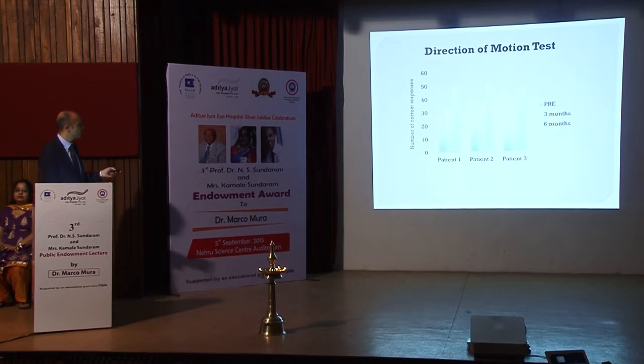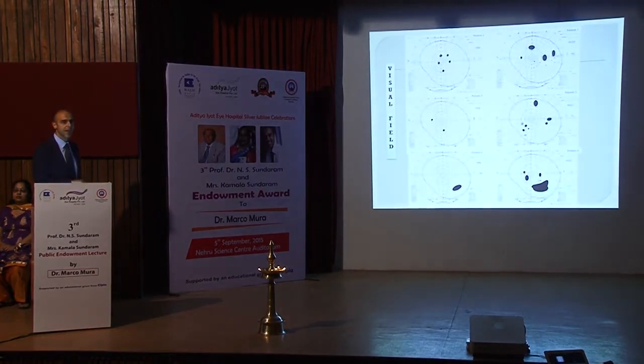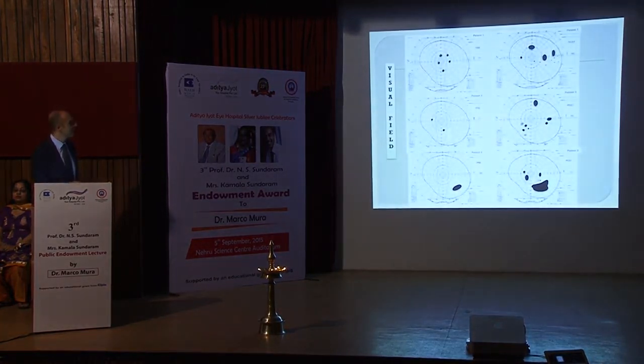And the same is true for the motion. There is a huge difference between pre and post surgery. This is also quite striking, and this is also a phenomenon which has been reported in animals, where we saw that due to the repeated stimulation of the ganglion cells with electricity, some areas in the retina of those people started to reactivate. Because if you check the visual field of those people before surgery and after, you see that those areas become much larger, and there are also some new areas that appeared in the test. Look, for example, this patient had only this area here. It became huge after reactivating it with electricity, and some other paracentral areas also appeared.